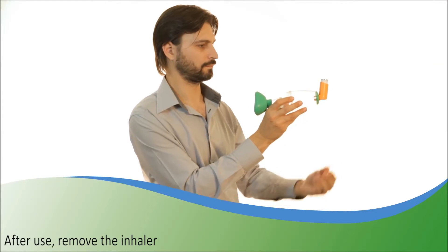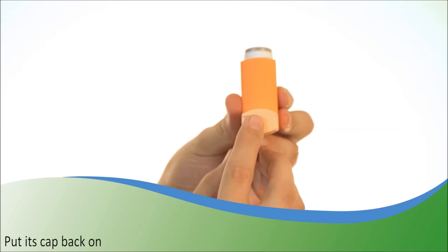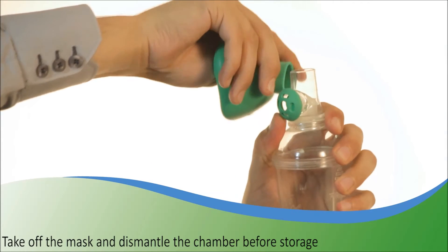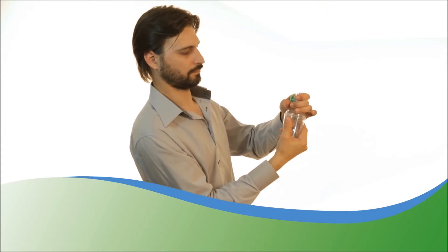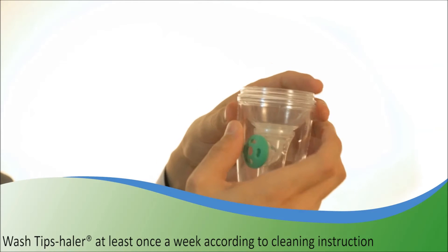After use, remove the metered dose inhaler and put its cap back on. You can store Tipshaler in its box after removing the mask from the chamber. Tipshaler must be washed once a week according to the instruction of use.